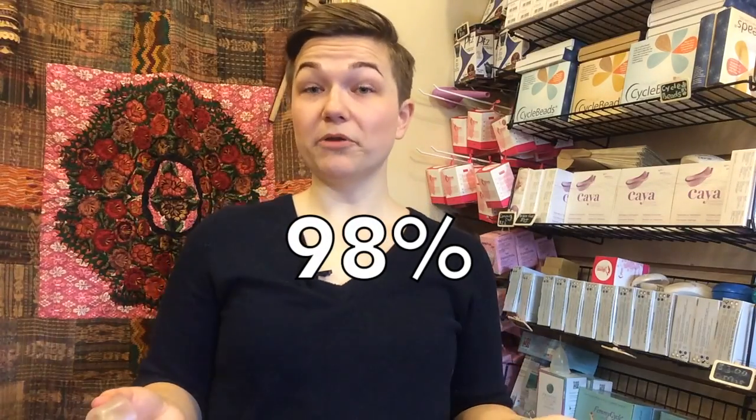Eva: So how effective are these birth control methods? Tynan: These methods are very effective. Perfect use with the FemCap is 98%, which is pretty great — that's actually very close to hormonal methods of birth control. Perfect use means putting it over the area, making sure it's sealed every time, and using it every time. What makes it so effective, and a little bit more effective than the Caya diaphragm, is that it comes in three different sizes.